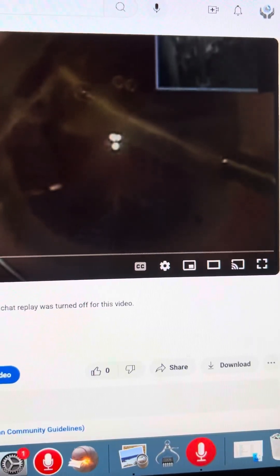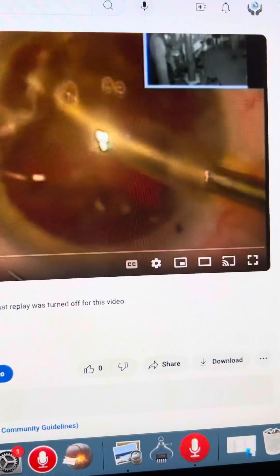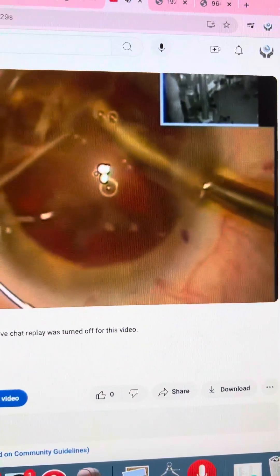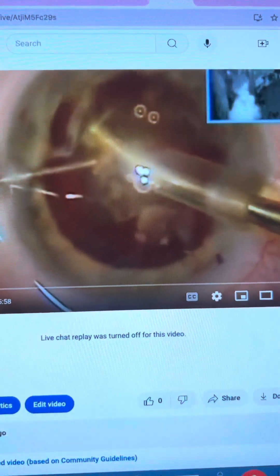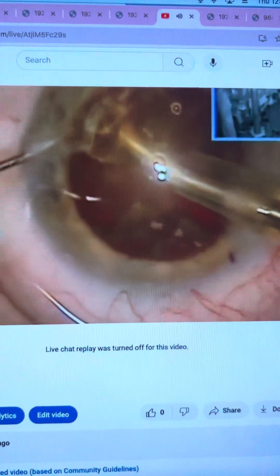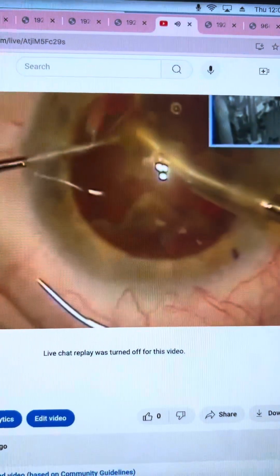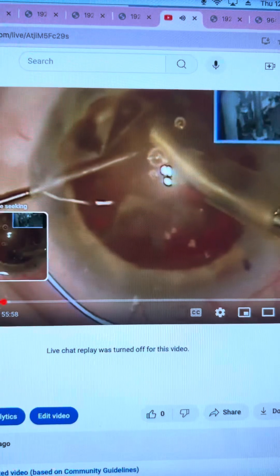I'm going to jump to a later stage where we're picking up the segments — very carefully, with a lot of Viscoat. Besides the fact that we know we're going to remove the endothelium, you can see these very dense pieces of nucleus on this retired pediatrician. To note, it's her only eye — her other eye sees only 20/200. She was count fingers in this eye due to a penetrating keratoplasty and severe glaucoma. Fortunately, this eye is better with glaucoma. She also had pseudoexfoliation, which makes this procedure challenging as well.